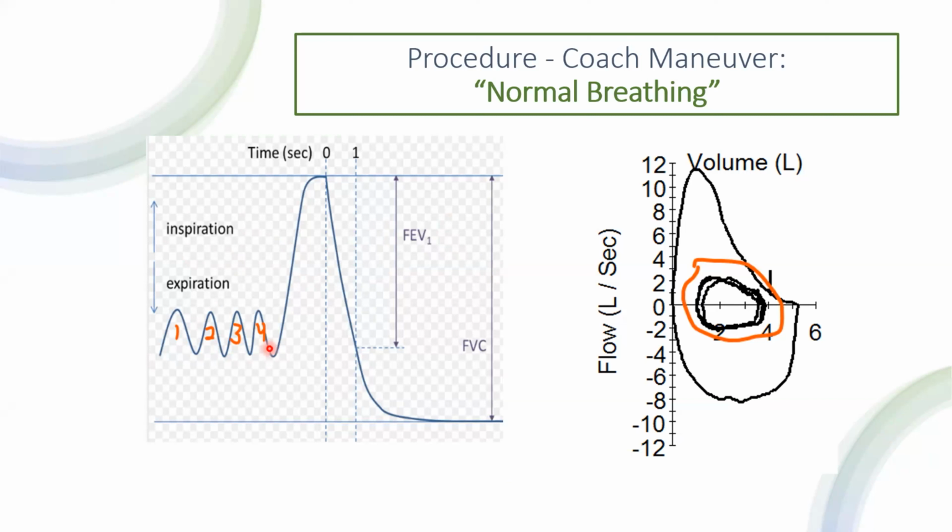Look for that nice, steady baseline stability, at least 3, preferably closer to 5 tidal breaths with end expiratory lung volumes within about 15% of that volume. You want to watch the flow volume loop for overlying tidal breaths. Are they moving to the right or are they moving to the left? They could be leaking. They could be stacking.